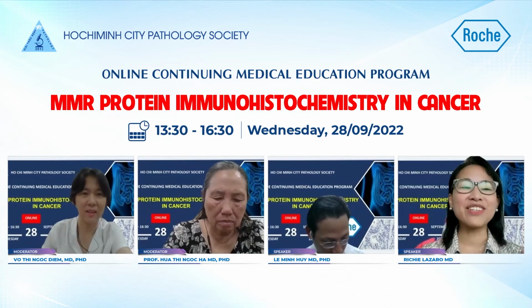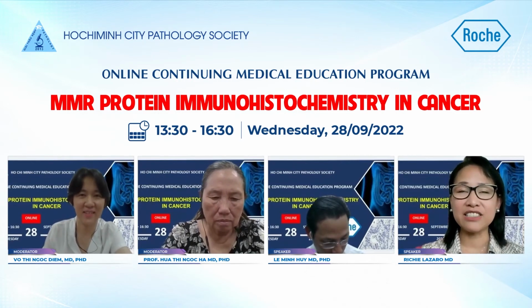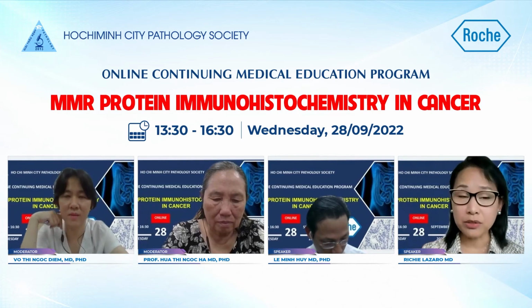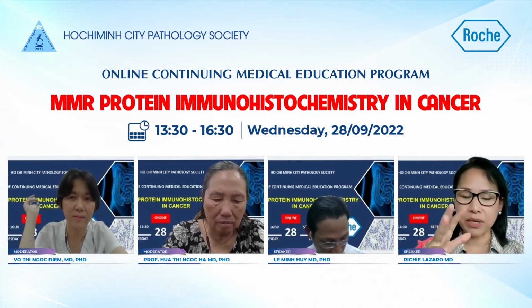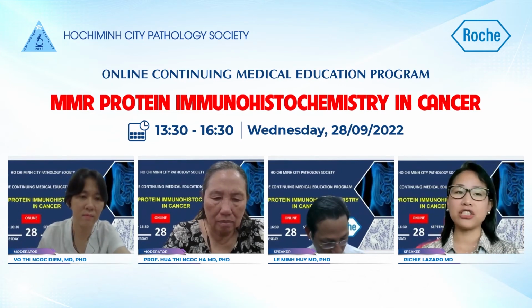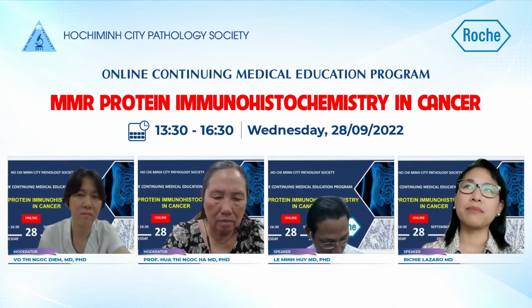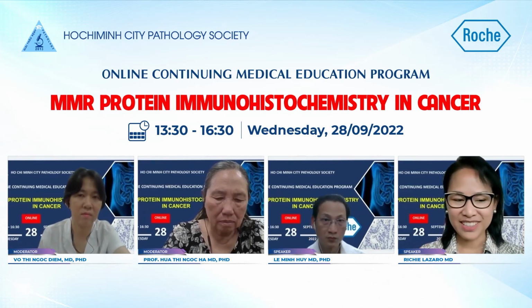Okay, the other examples that I gave in my talk for focal staining is in treated specimens. If there's neoadjuvant chemotherapy performed, it is possible to show focal strong positive, but only a portion, let's say less than 10%. That's another explanation. So it helps to know the clinical background of the patient. Also, and then again, evaluating the tissue as a whole.